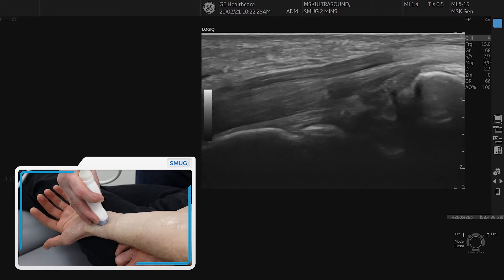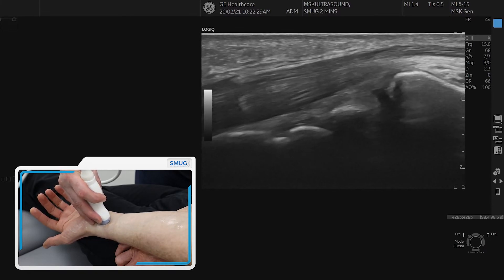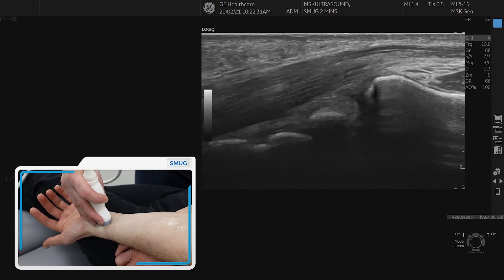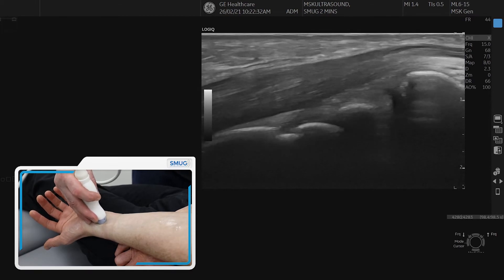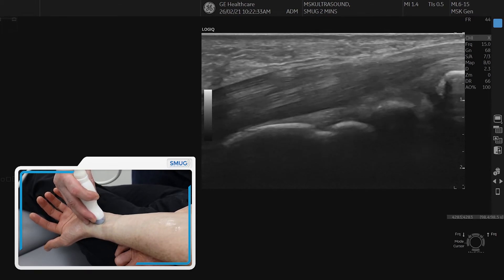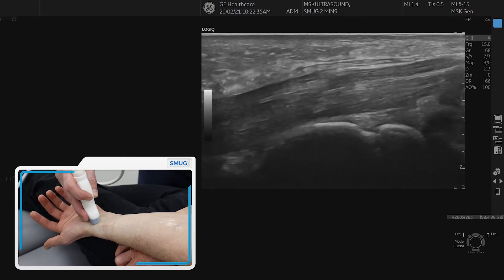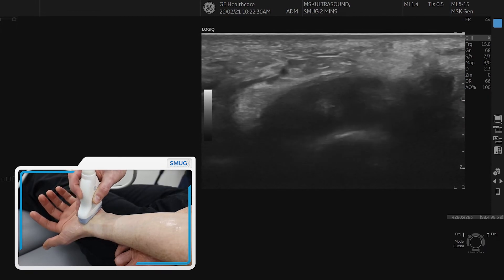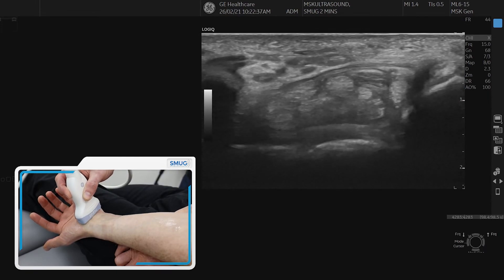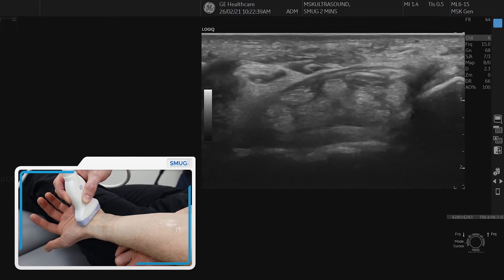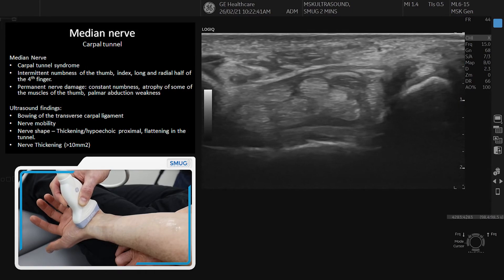In longitudinal you can trace it more proximal to the carpal tunnel or more distally. That is the median nerve in the carpal tunnel and the flexor tendons around there.